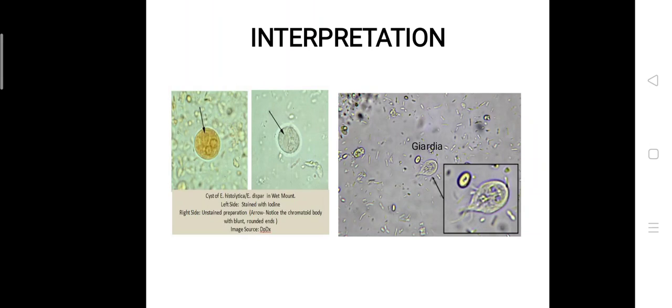There are some limitations of this wet mount preparation for stool. Once iodine is added to the preparation, the organisms will be killed and the motility will be lost. That is why the iodine preparation is usually used for cell morphology, whereas in saline we look for motility. Oil immersion examination is not recommended, as if you use oil immersion, the organism morphology might not be that clear. So this is all about the wet mount preparation of stool for saline and iodine.